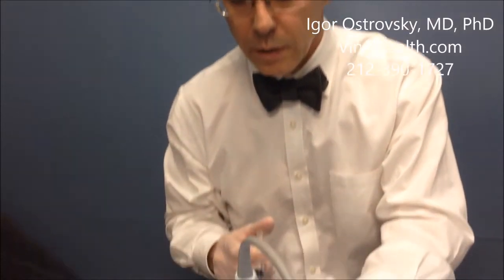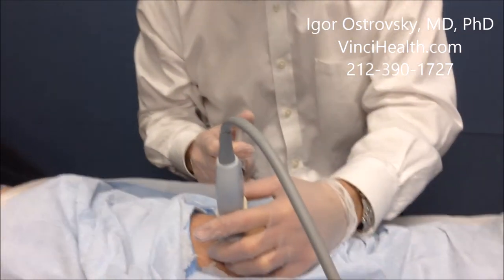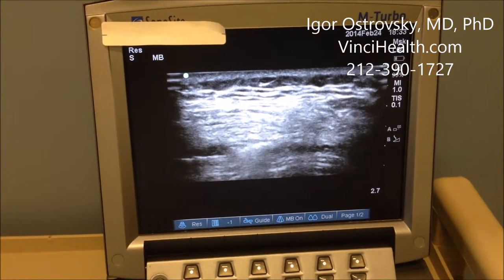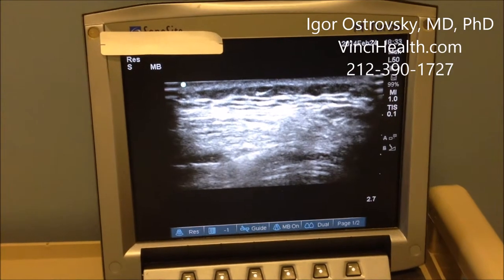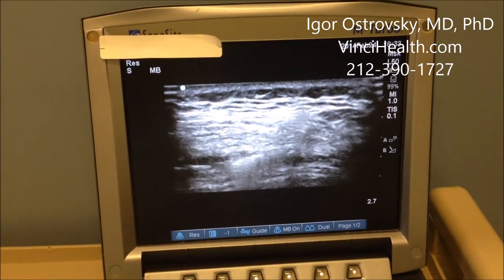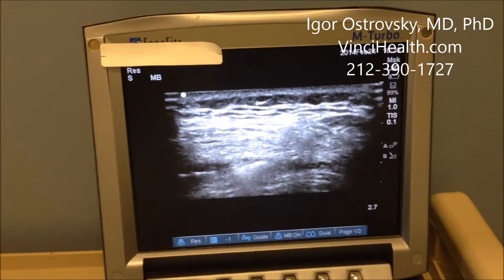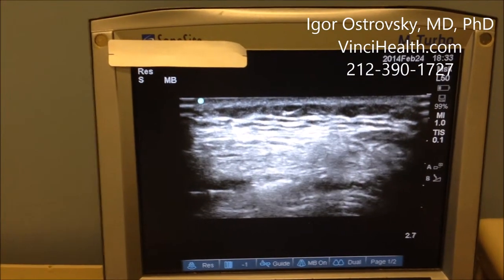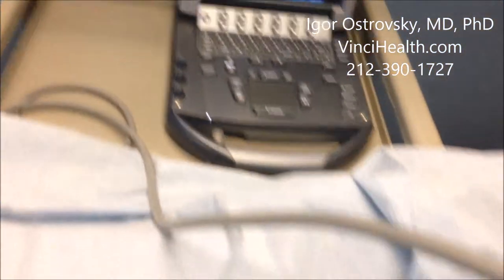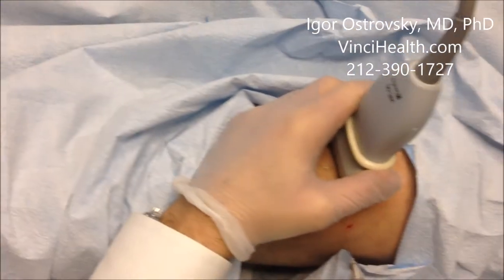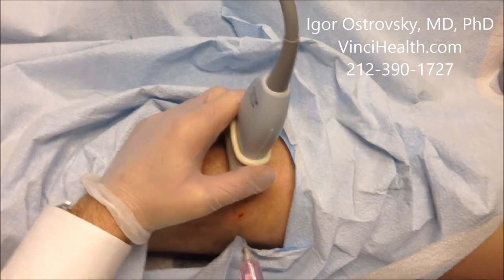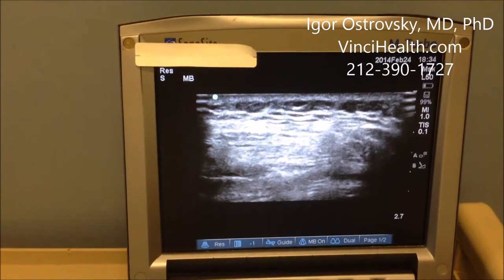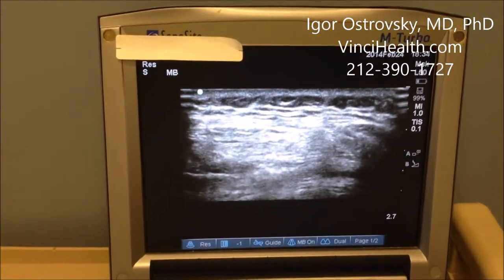First, I will inject local anesthetic lidocaine to numb the area. I am now injecting local anesthetic into the suprapatellar recess — a space between the fascia that connects to the joint space. I don't go inside the joint itself, but into the recess of the joint.